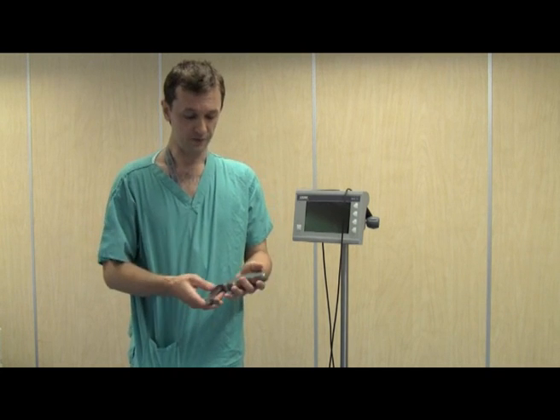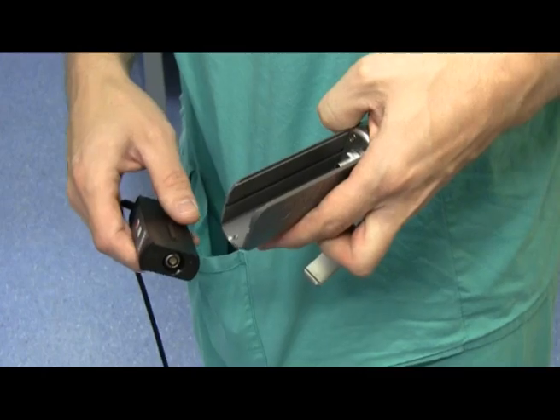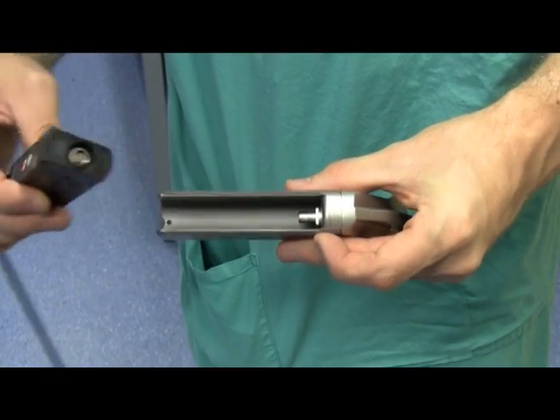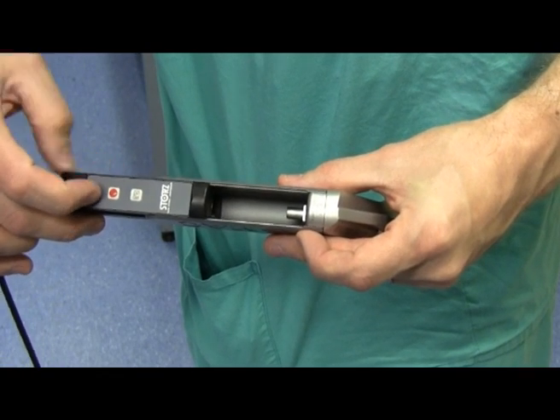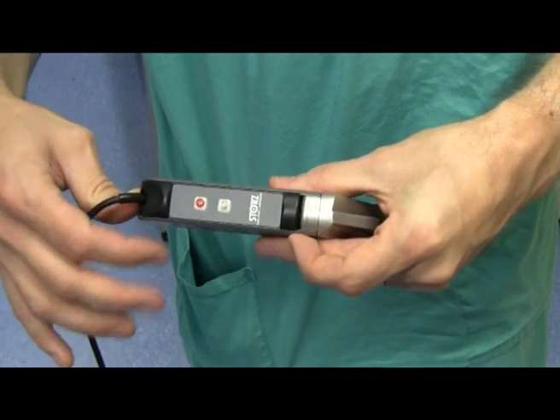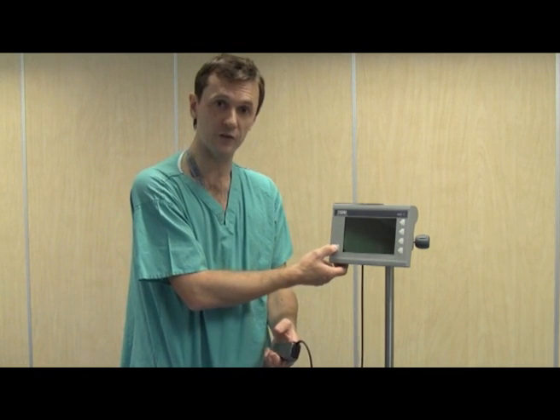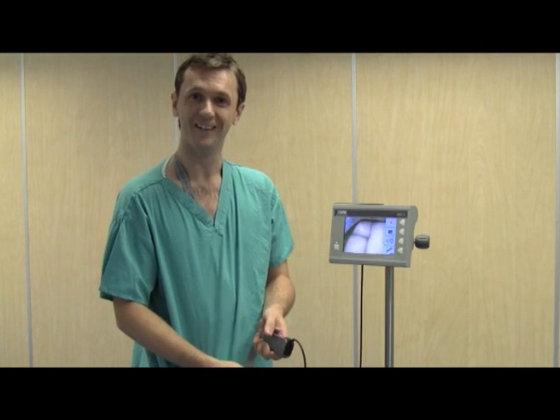Now I'll take you through laryngoscopy with the C-Mac step-by-step. The C-Mac system consists of the laryngoscope itself and a video viewer. Place the camera into the housing on the handle of the C-Mac laryngoscope — slide it in, making sure that the coloured buttons are facing outwards, slide it in and click. Then you turn the video viewer on by pressing the button on the bottom left of the screen.